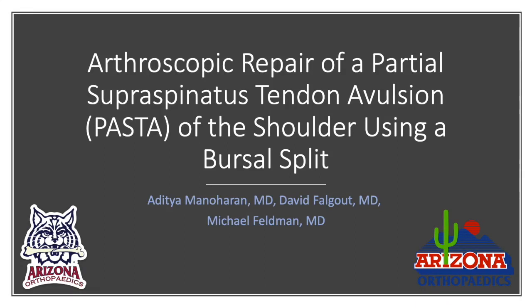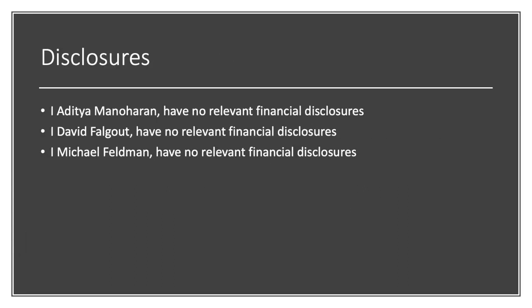We present our technique of arthroscopic pasta repair using a bursal split. The advantage of this technique is that it allows for excellent manipulation of instruments through the subacromial space while preserving any intact Sharpey fiber attachments to the rotator cuff footprint.